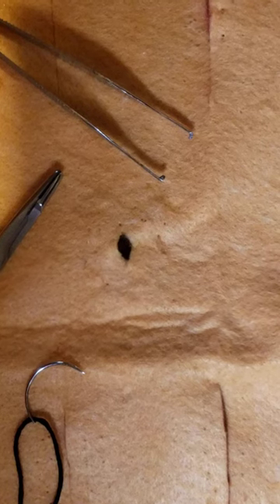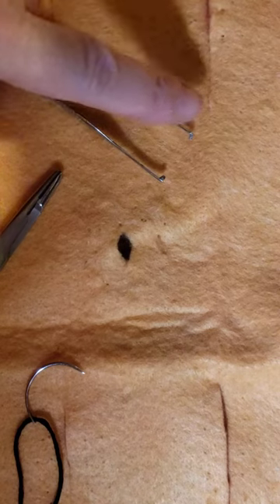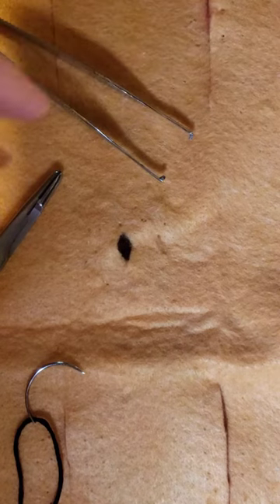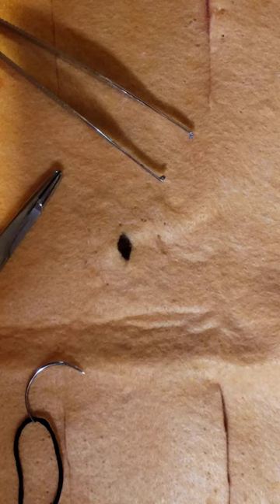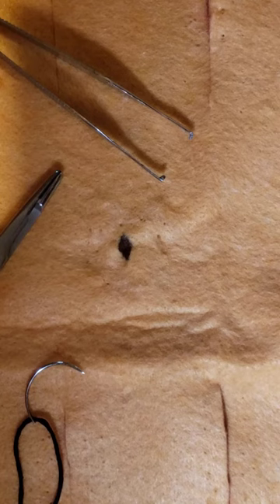Most of the suture patterns that I've been showing you have to deal with closing of an incision. In this case, I'm going to demonstrate how to perform a purse string suture. For that, you need just an opening, and it's typically done on a surgery like an anal gland removal surgery, where the doctor might ask you to cinch the rectum closed so that the animal doesn't defecate in the actual incision.